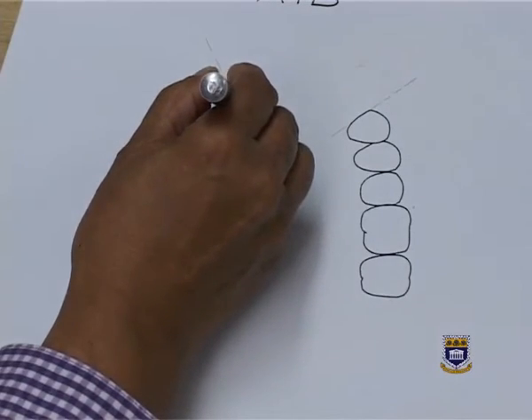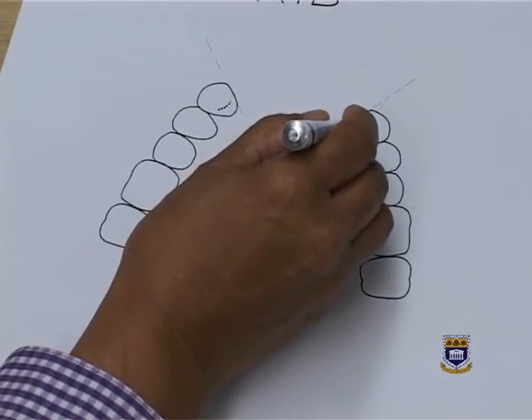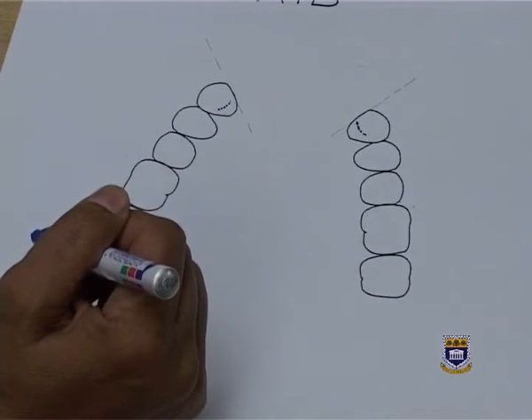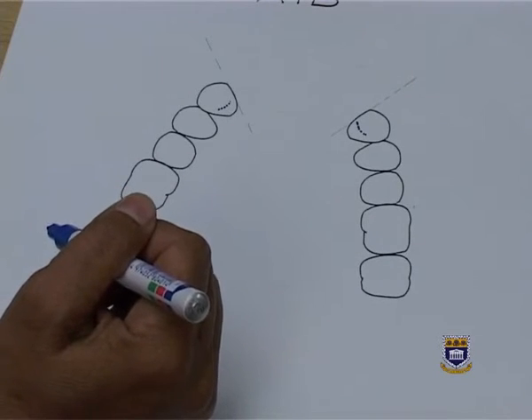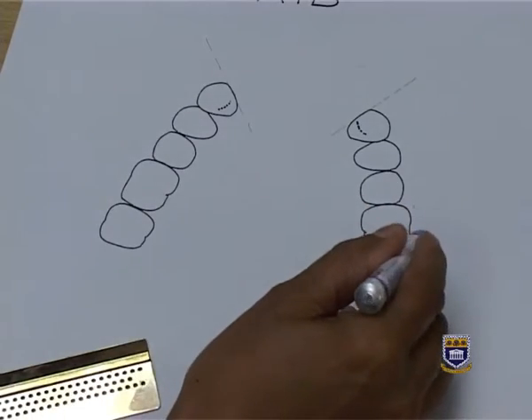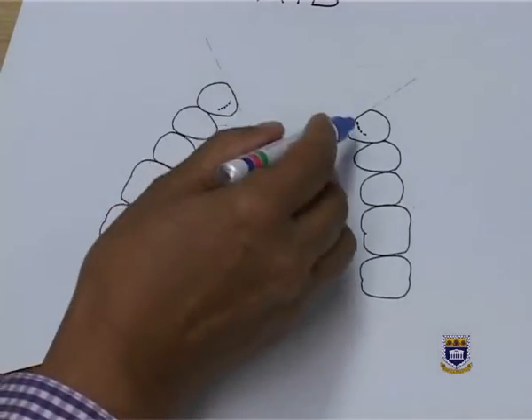And because we have two canines here, I will indicate that we will be using the canines. And we've got two rests, and support has to do with providing a partial denture that has 3 rests. Remember the 3-legged stool, and the third rest will usually come from our clasp, which will go through the embrasure area. So we've identified our support.